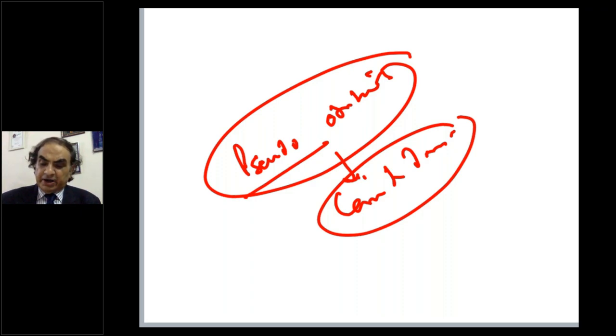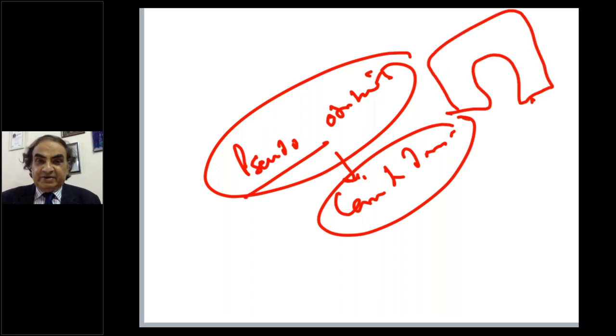You have a large bowel dilatation for no reason. And even if you find a reason, what are you going to do? Nothing. So you may do an ileostomy, that's what a lot of people do. They may do a colostomy, sigmoid, etc. It has a role. You're doing laparotomy, you can put in a scope. But the important problem is, with a distended bowel, you may puncture the bowel. That's the complication of putting in trocars or the pneumoperitoneum needles.